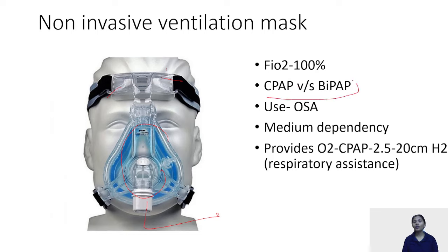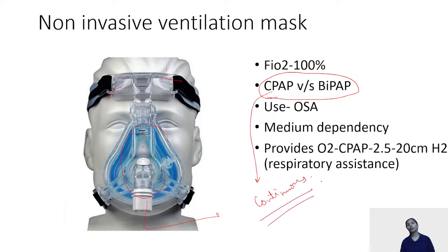When I talk about CPAP and BiPAP, as the name suggests, we are going to discuss it very briefly. CPAP means continuous positive airway pressure, during inspiration as well as during expiration. The inspiratory pressure and the expiratory pressure, both pressures are the same.